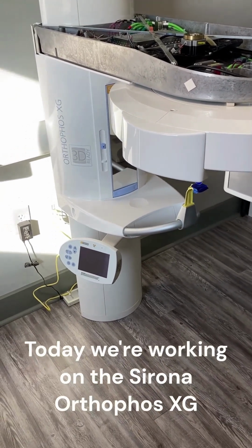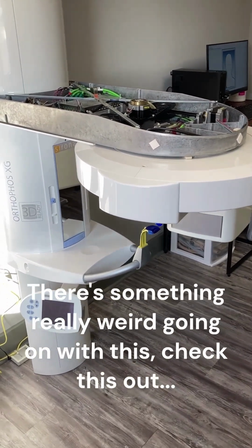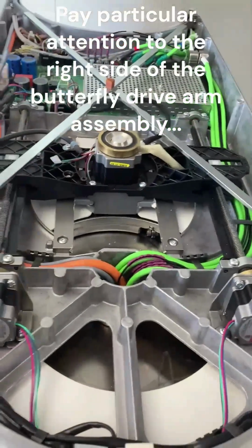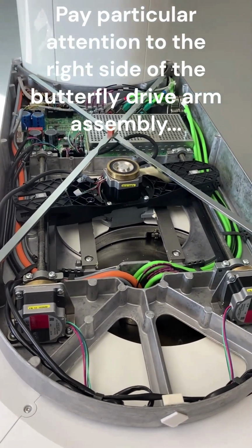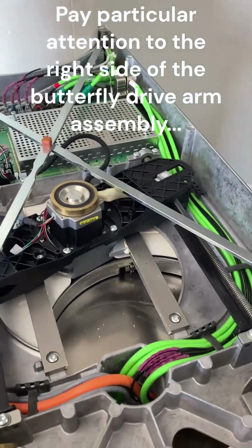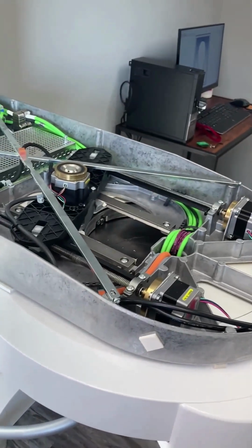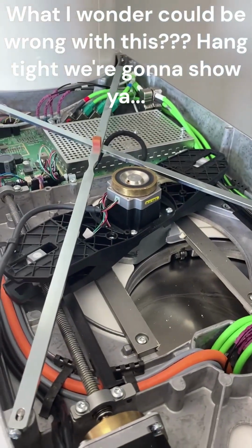Today we're working on the Sirona Orthophos XG. There's something really weird going on with this. Check this out. I'm gonna go ahead and hit the return key. And watch what happens. Oh no, that's not good. What, I wonder, could be wrong with this? Hang tight, we're going to show you.